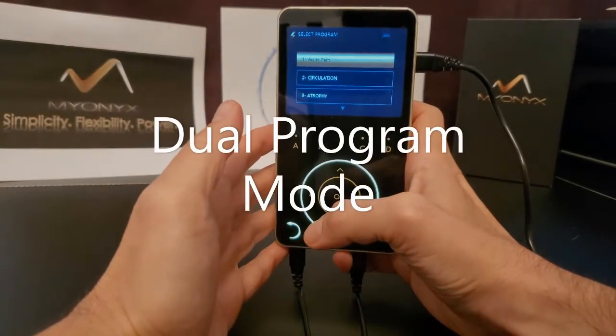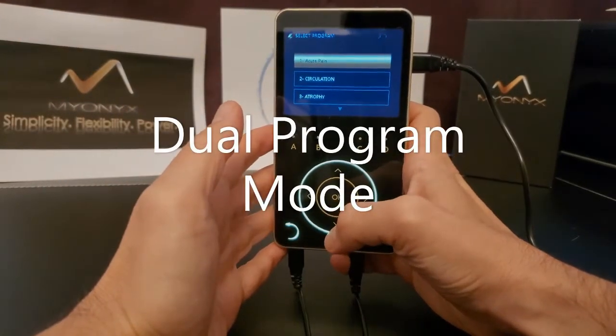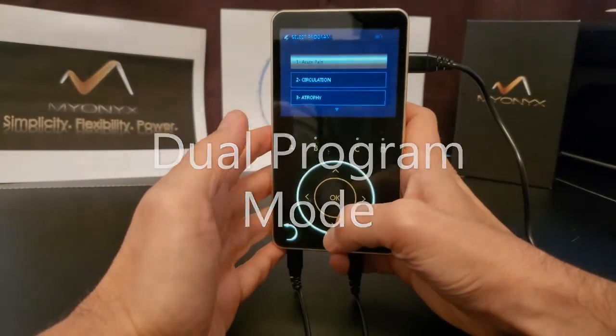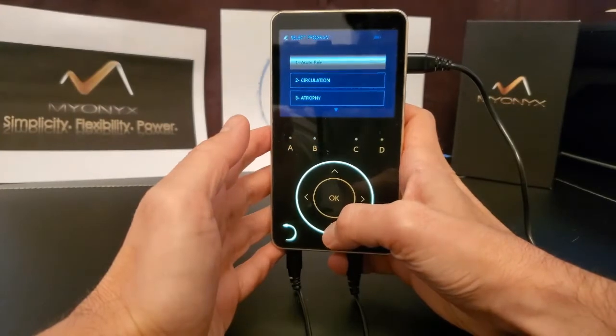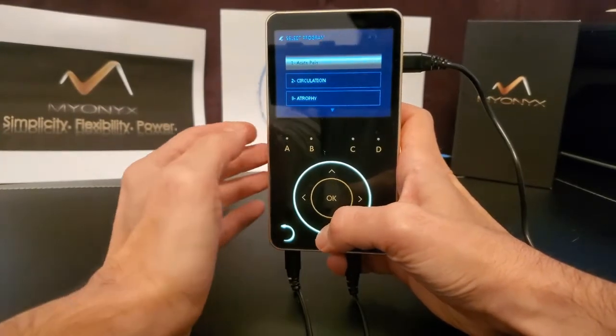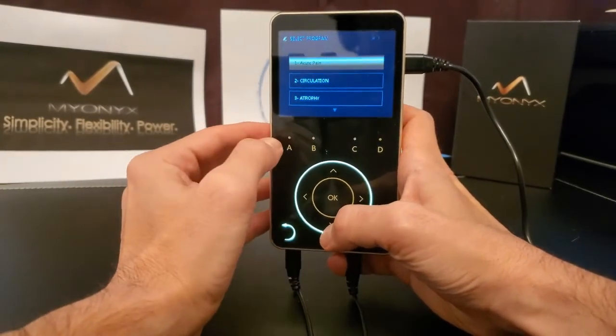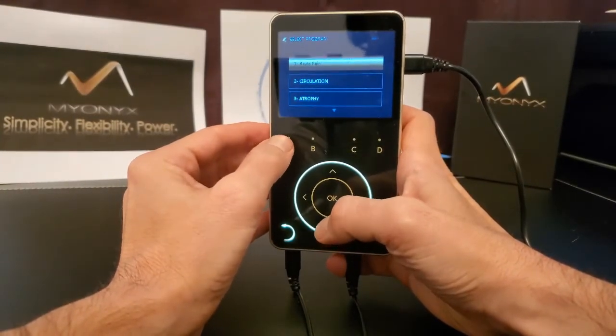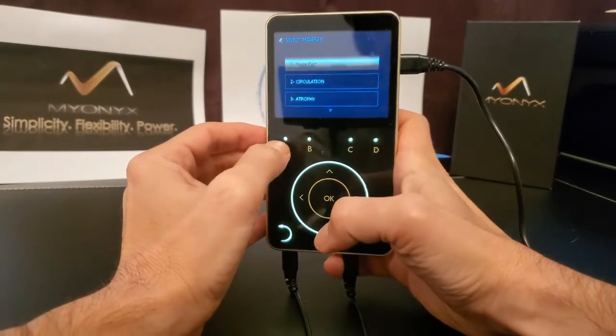In order to use two separate electrostimulation programs at once, from the Program menu, select one of the pairs: A or B, or C and D.